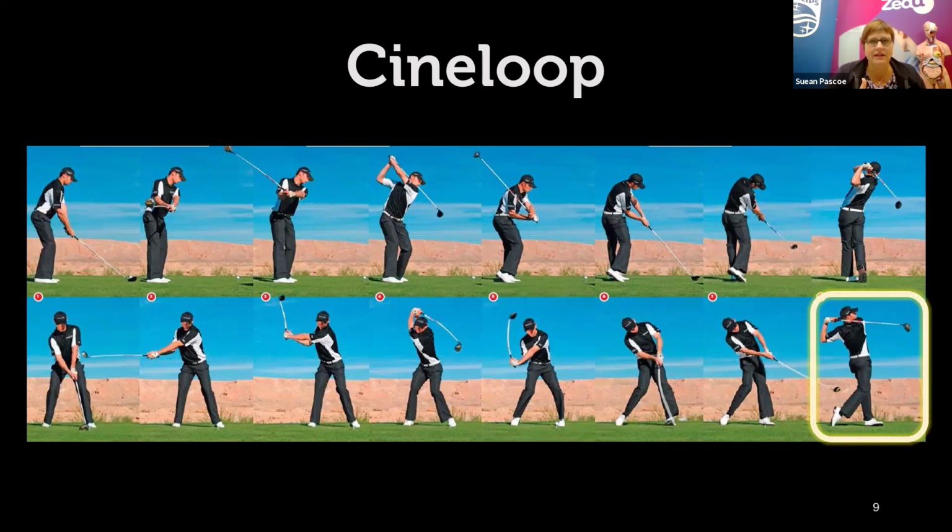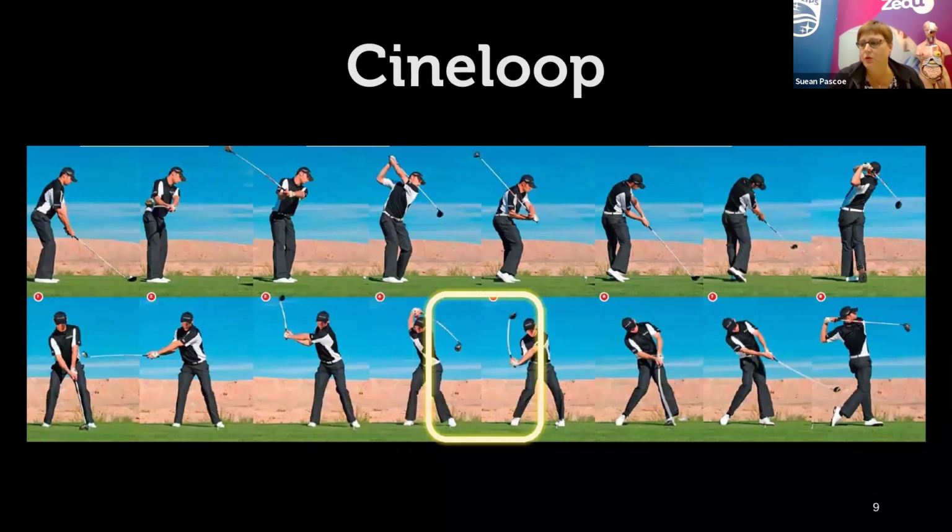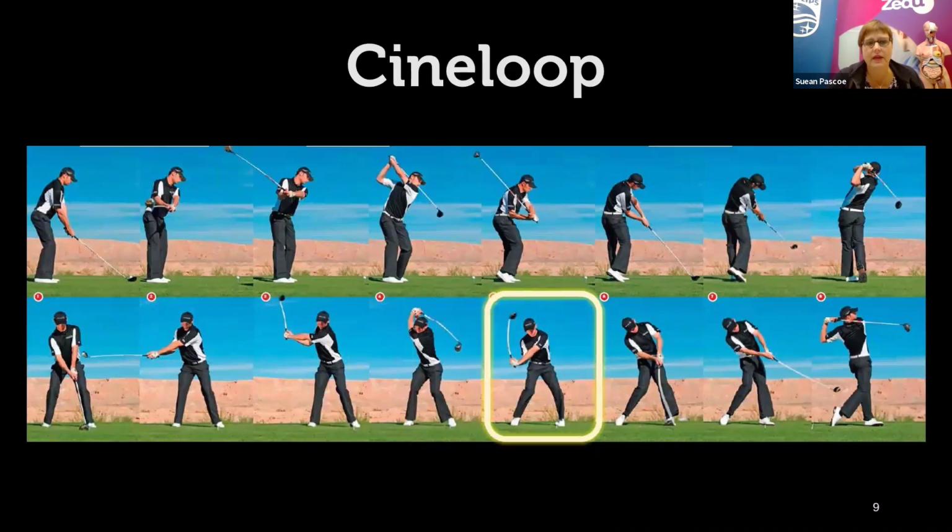You might have captured or gone quickly past the bile duct as you're scanning. And when you push freeze, you can rewind the machine with the cine loop function and fast forward until you get to just the frame that you need to look at. So don't forget to use the cine loop button. It's one of your best friends, especially for the bile duct.